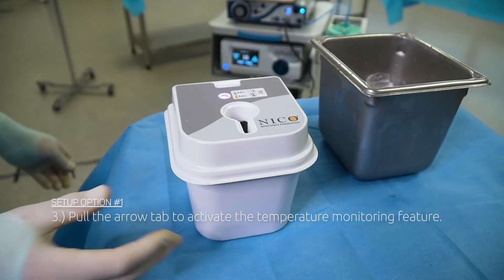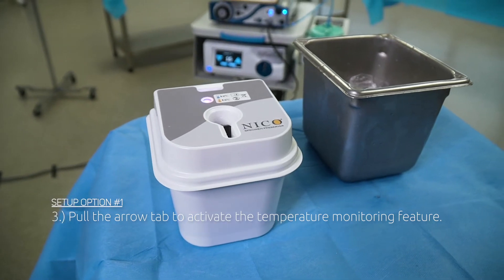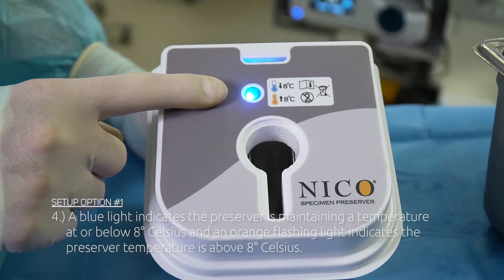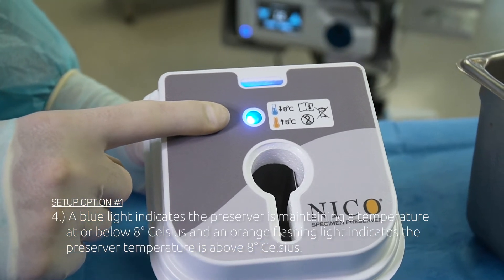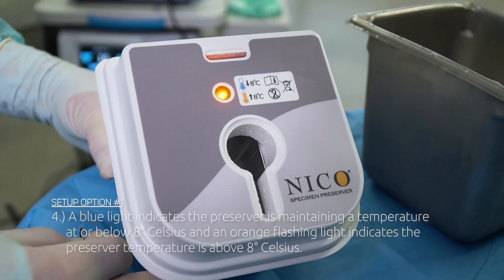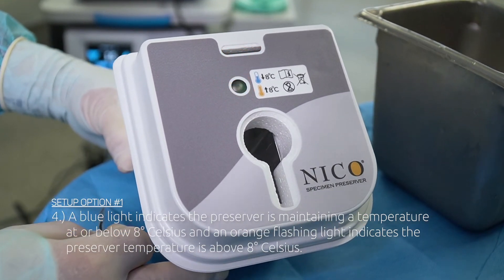Step 3: Pull the arrow tab to activate the temperature monitoring feature. Step 4: A blue light indicates the preserver is maintaining a temperature at or below 8 degrees Celsius, and an orange flashing light indicates the preserver temperature is above 8 degrees Celsius.